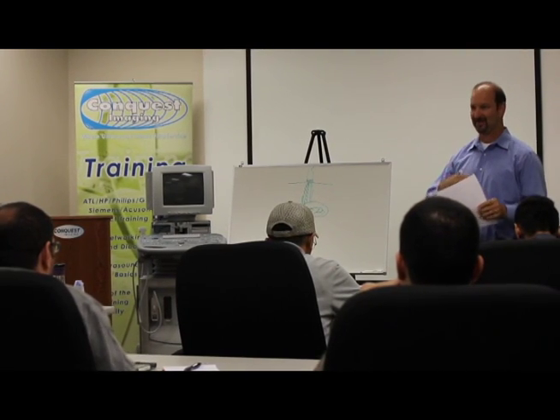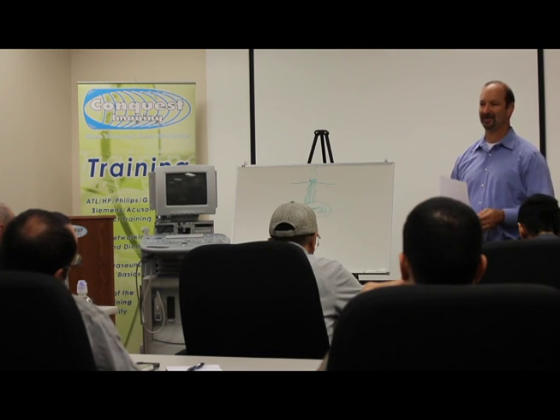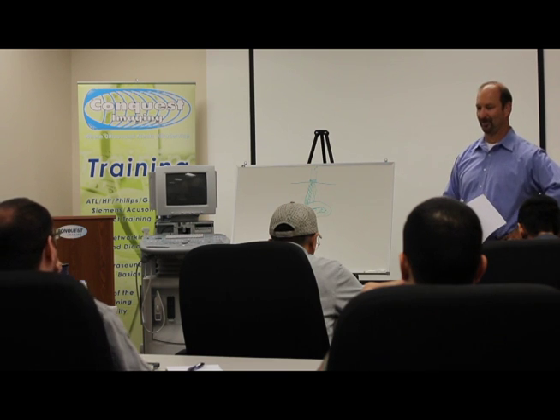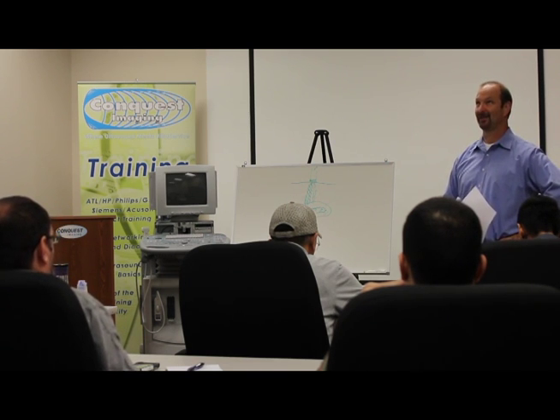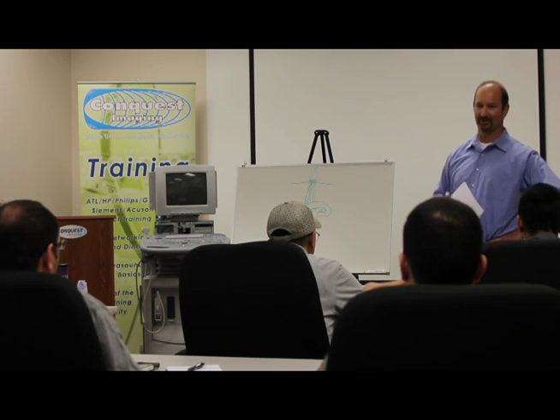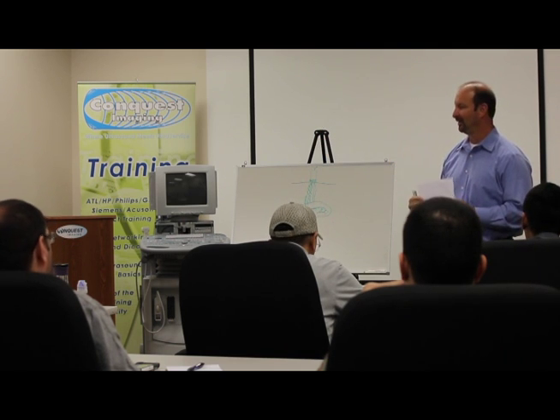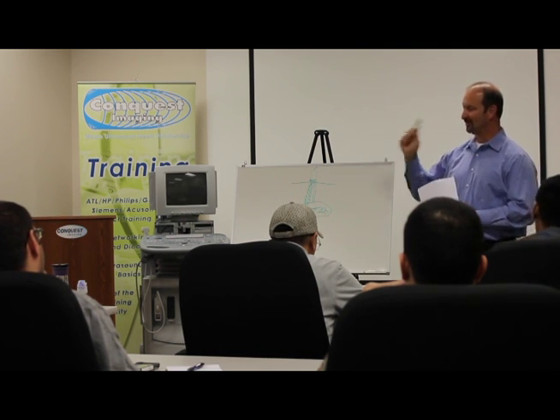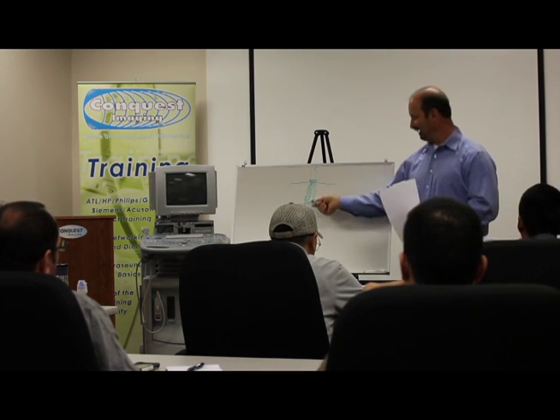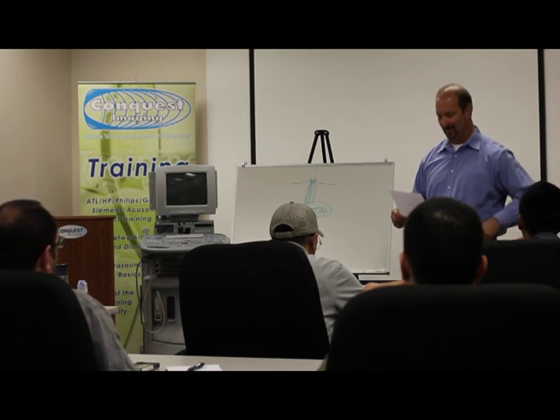Well, you're not sending stuff meters, you're sending stuff 15 centimeters. So 1,540 meters, add 2 zeros to that, is 154,000 centimeters per second. Sound goes there, and then it takes that amount of time to come back. So it's doing all of that at that very near image, and depending on how long it takes the information to come back, the machine decides what type of tissue it is.